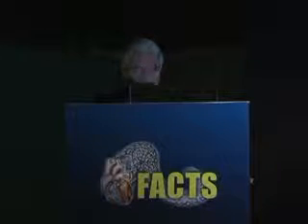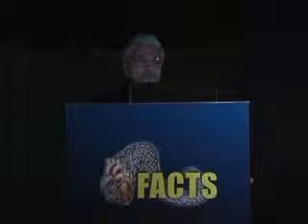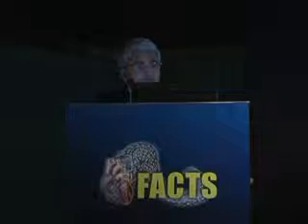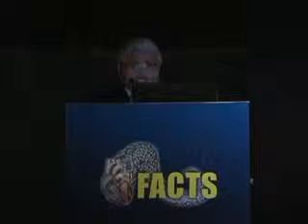And these two slides I owe to Dr. Bharat Dalvi. These are instances which he uses to say which fistulas you can say directly, we don't want to deal with this. This is one instance. This is obviously small, normal coronaries, but with small fistulae leading from both the branches of the left. But here, in the next one, in a 72-year-old patient, you look at this fistula coming off the left main, they are pretty large. But again, whatever you want to do, you want to manipulate through the left main. And with the normal coronaries, why would you want to interfere with the left coronary in that?